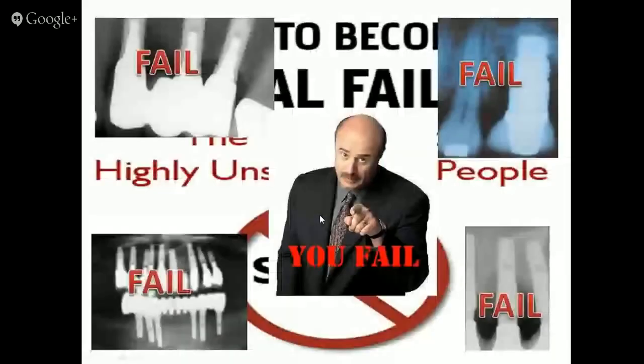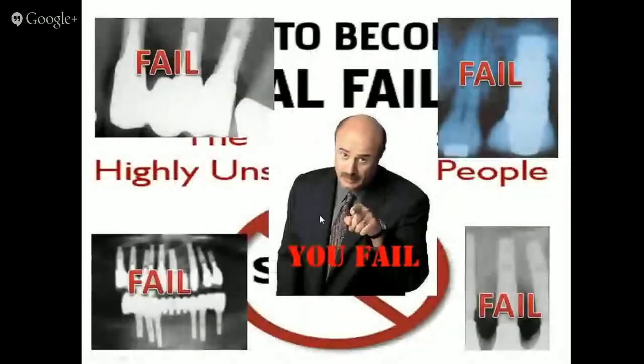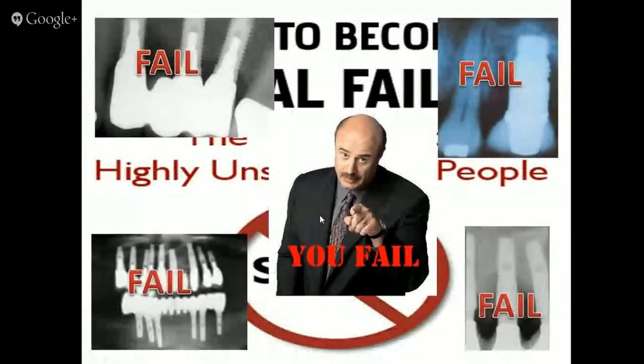The patient comes to you for replacement of a missing tooth. You give him a bridge or an implant, he wants a tooth back. So what we have to understand is that the restorative component is of utmost importance. If we are giving an implant, we have to make sure that not only the surgical protocol is taken into consideration, but the restorative aspects also are considered. Otherwise, we encounter a lot of problems, even from an abutment screw loosening, which is the most commonly encountered, to the most severe, which is actually the wobbling of the implant, wherein we have to use a trephine and take it out. We shouldn't reach that stage ever.